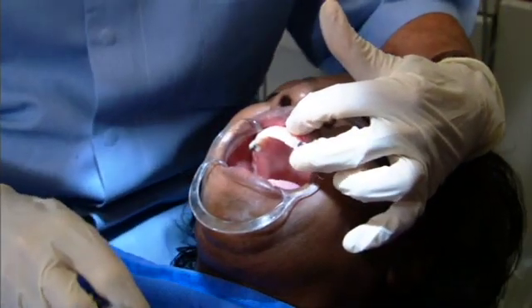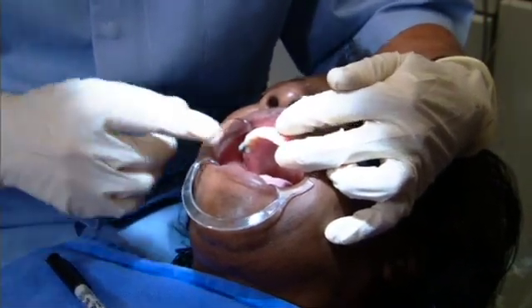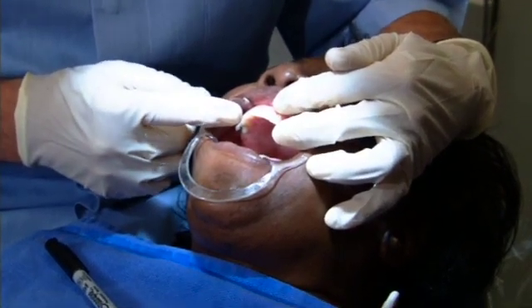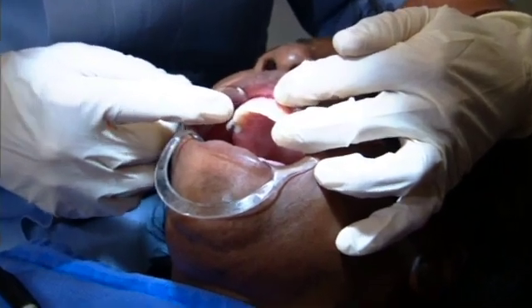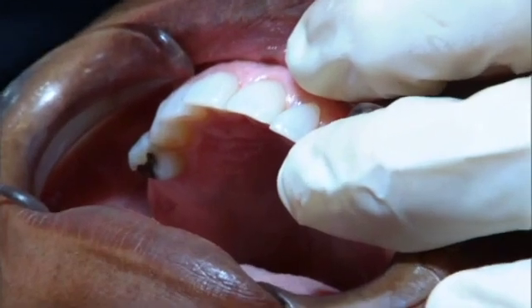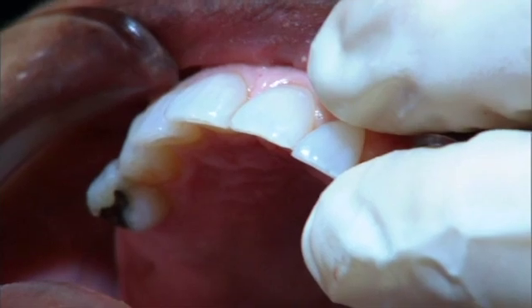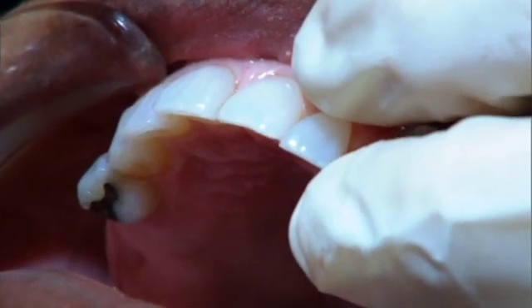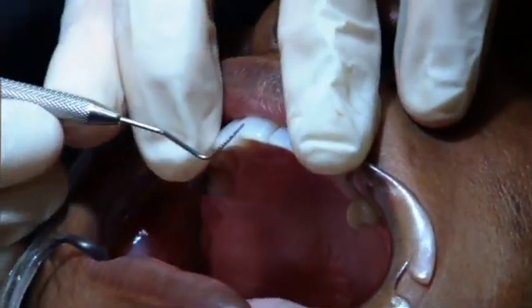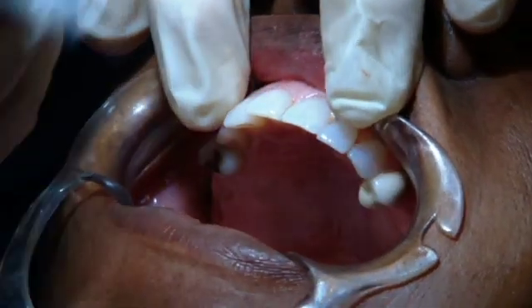With our crown and bridge, our goal is to build a case from the outside in. I want to determine the external parameters of the surfaces of the teeth in conjunction with the neutral zone. So I've got to get enough tooth structure out of the way so that the laboratory technicians have room to put metal, porcelain, opaque, any attachments that we need. So we want to make sure that we work with what I would call a pattern. I would like to be able to get 1 3/4 to 2 millimeters of incisal edge reduction.